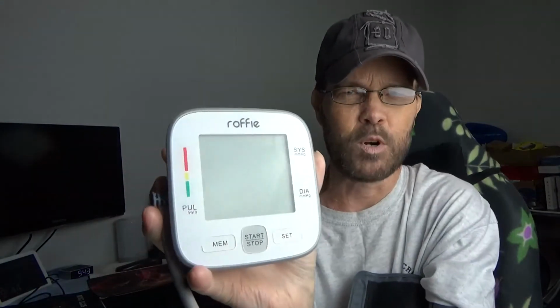But yeah, very easy to see, and as you heard, not loud, easy to operate, pretty much just to push the button and wait. Helps if you're not speaking like I was previously, and if you're sitting really still, which I wasn't. But that's just a very simple operation. I mean, can't really ask for anything more. And if I push the memory button, you can see it pulls up the last. So, but that's it. Just a quick overview, give you an idea of what it sounds like.